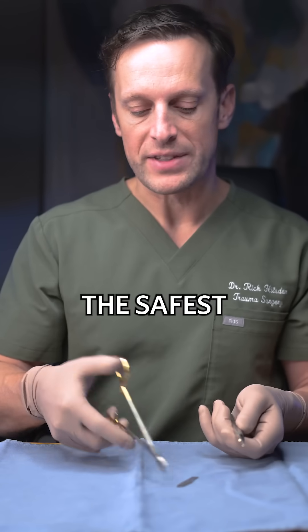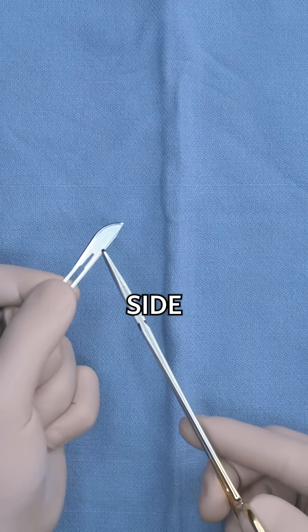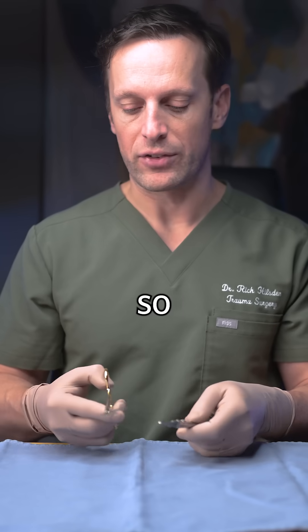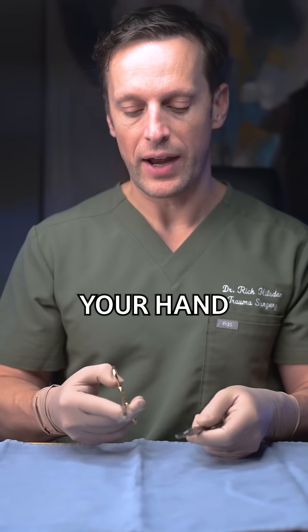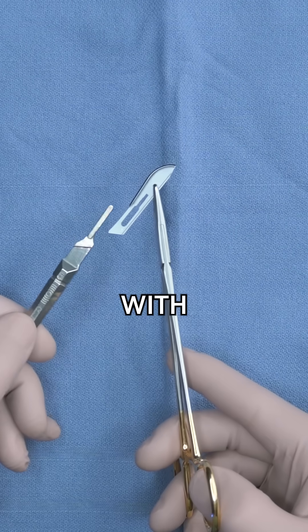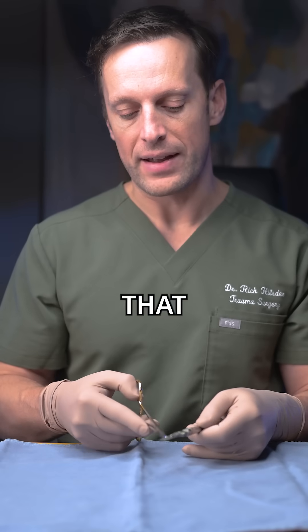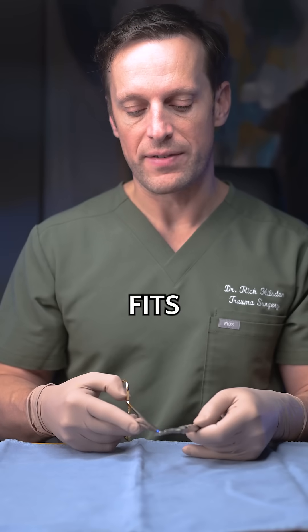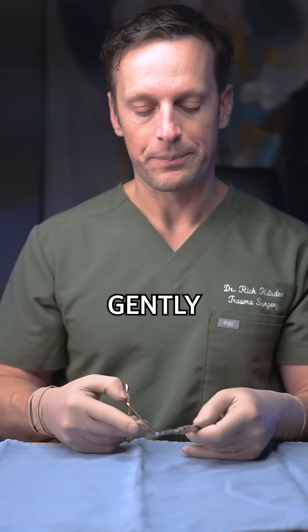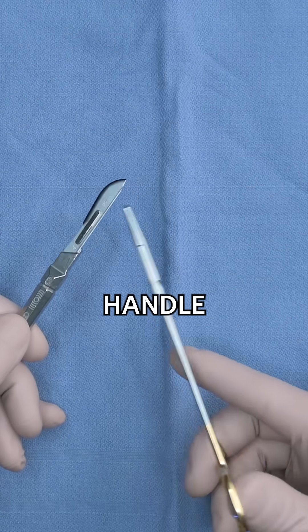The safest way to load a scalpel is to grab it on the dull side with an instrument, lightly holding it in your hand. You'll match the keyhole with the handle groove and find that fenestrated slot once it fits in gently. With a little bit of gentle force you just slide it on to your scalpel handle.